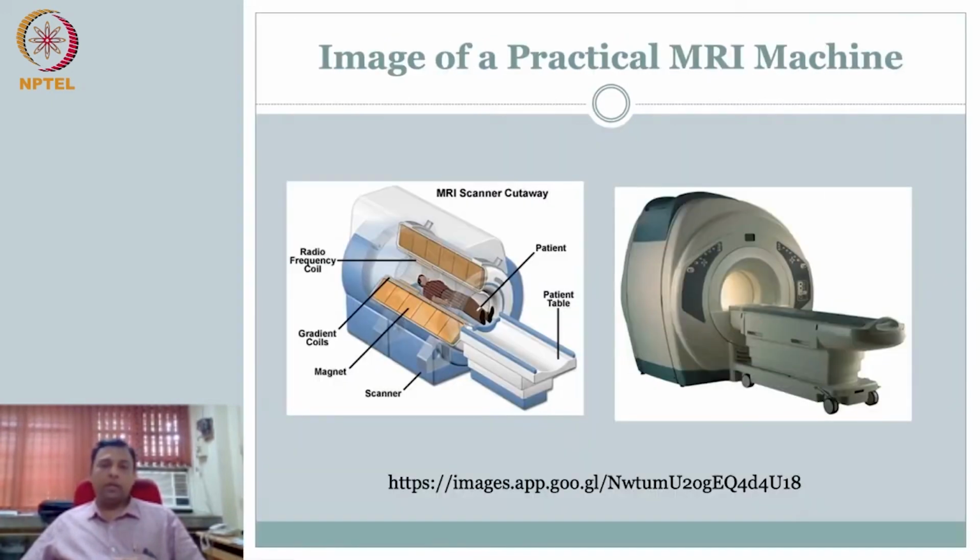Okay. This is how a typical MRI looks, I'm sure you would have seen it. You have a bench, that is the big board that you see. Patient goes in. A very important point that I would like you to note: until now we covered physics. I've always been saying floor to roof as your Z, because it is easy for me to do this, and the transverse XY was my floor.